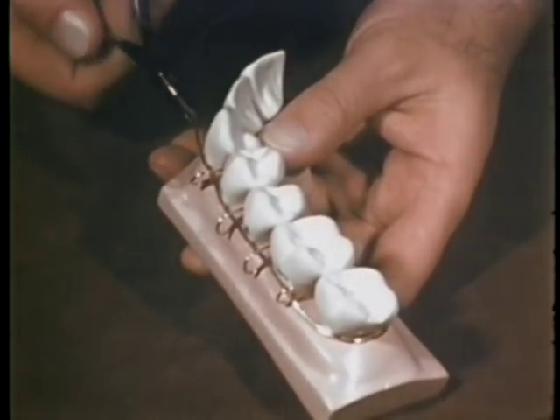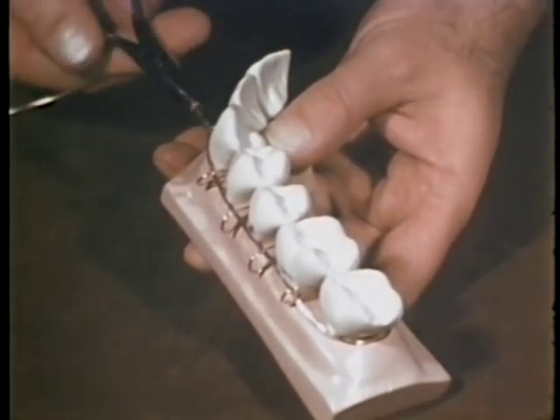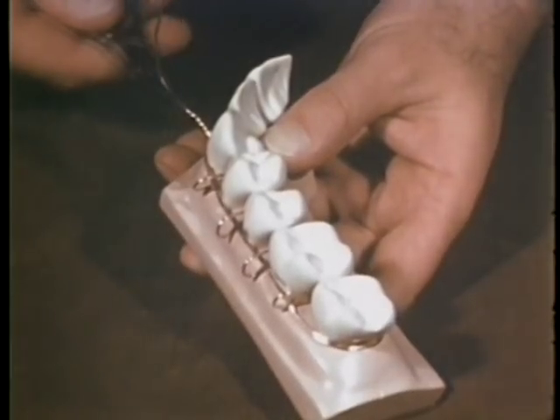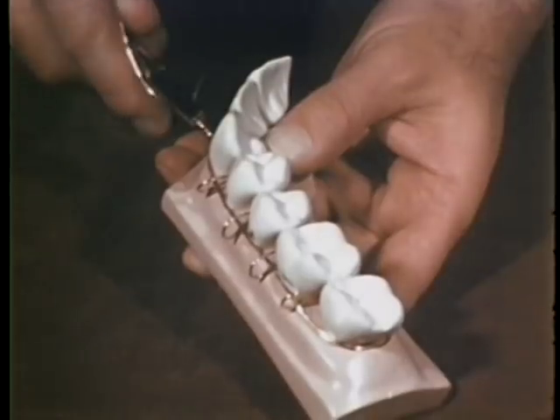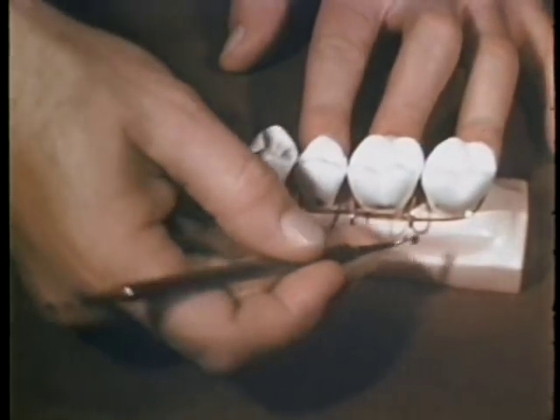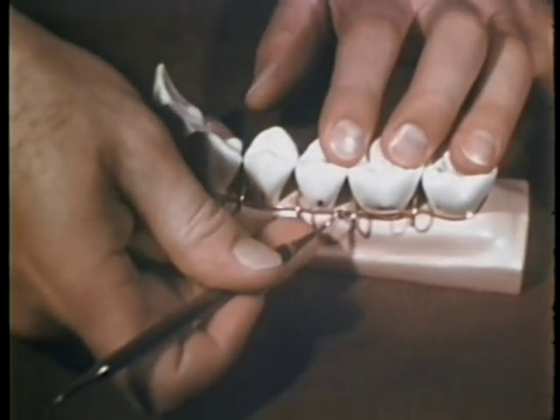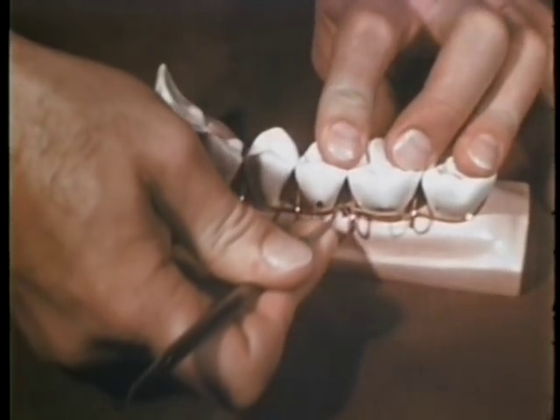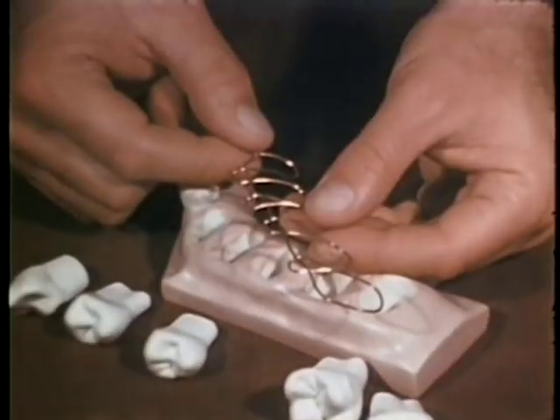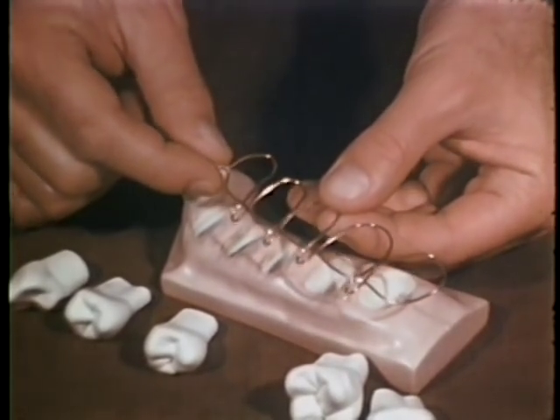Flat nose pliers, number 104, instead of needle holders, were used in the original technique in the preliminary twisting together of the horizontal and working wires at the mesial angle of the canine tooth. The horizontal wire is depressed into the interproximal embrasures using a Ladmore plugger or any suitable instrument. One length of wire has been used to incorporate five teeth, distinguishing this multiple or continuous loop wiring from other methods.